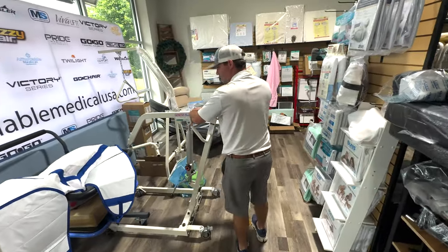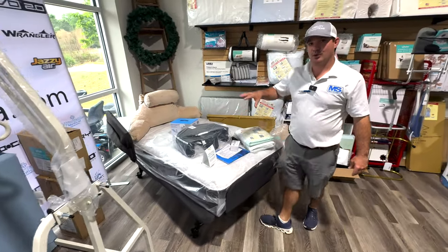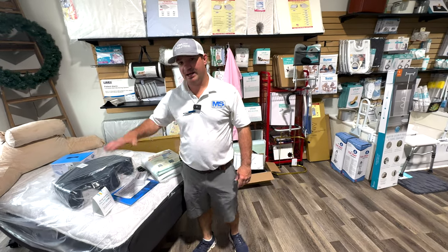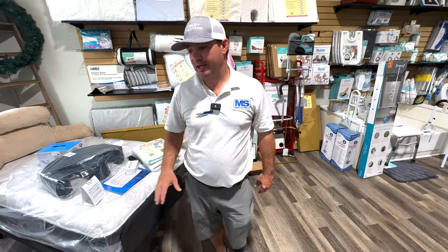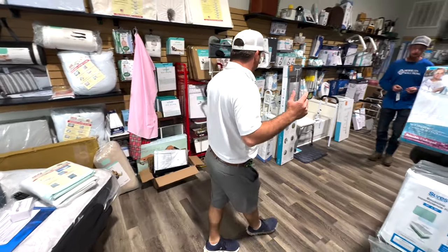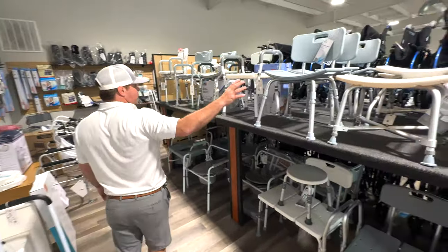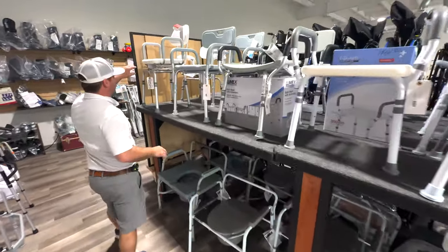Adjustable beds — we have them. Right now we're displaying the Flex-a-Bed, but we could be bringing in Golden's new adjustable bed soon. The Flex-a-Bed is a high-low bed that goes up and down with power, more of a home care bed — available in twin, full, queen, dual, and king. Over here are some shower chairs, from very affordable options to one of my favorite shower chairs, which is a swivel.